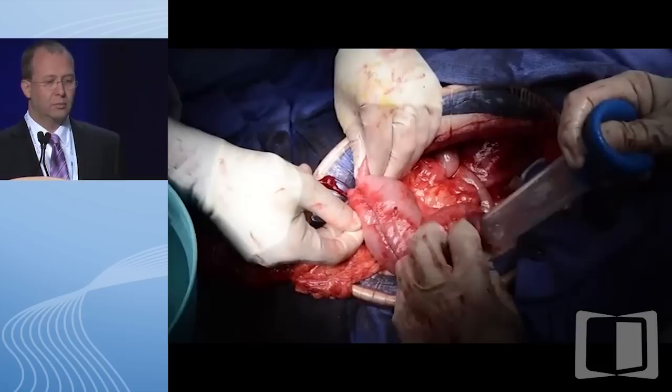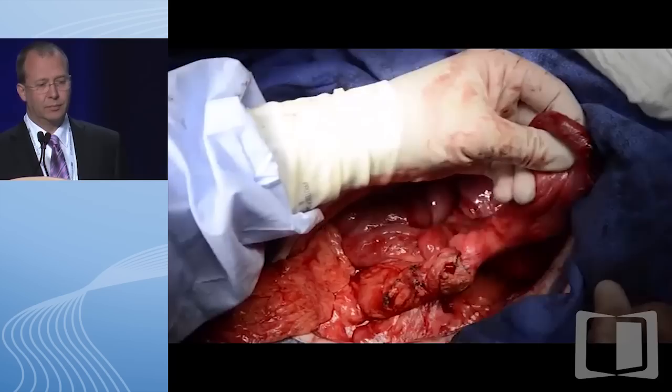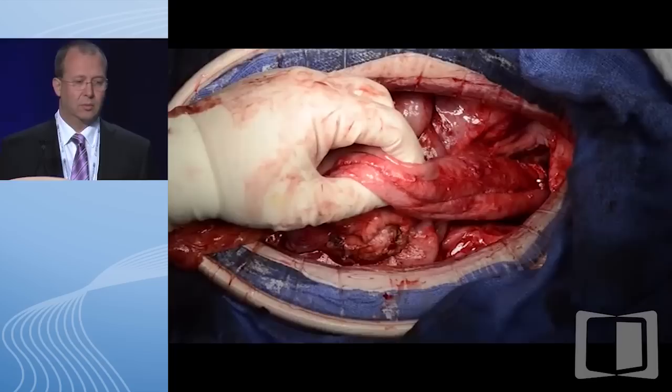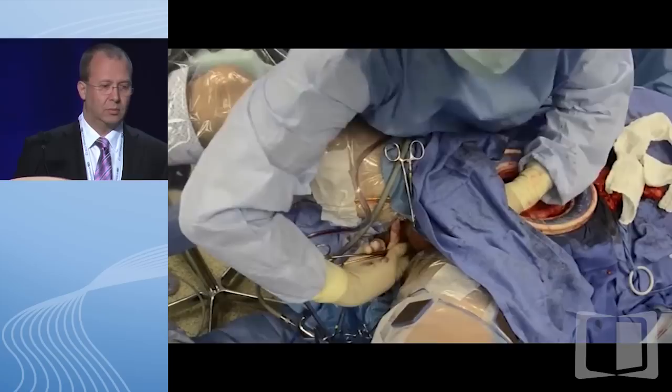Once again, reach is assessed prior to passing the newly created pouch on a long Babcock down towards the anal canal, where a hand-sewn pouch anal anastomosis will be created. While doing this, it is very important to do this as a bimanual procedure, ensuring that the pouch is not passed under tension and is not damaged during its passage to the anal canal. One can also ensure at this time the normal alignment of the mesentery and the small intestine.